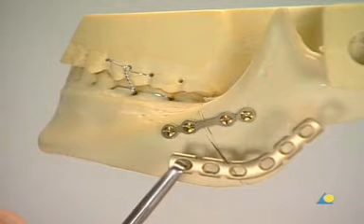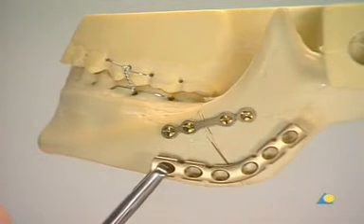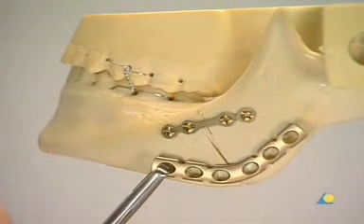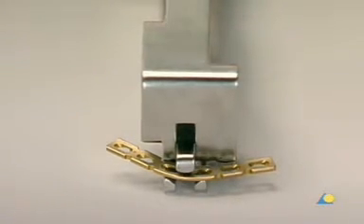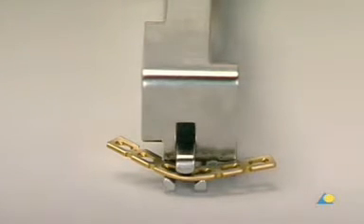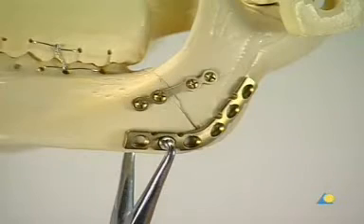An angled 2.4 universal fracture plate with 6 holes is selected to be attached to the lower border of the mandible with 3 screws on each side of the fracture. The bending pliers are used to contour the plate precisely to the mandible. A small degree of overbending is advisable so that the fracture does not open up on its lingual aspect. If the surgical approach is external, the contoured plate is held in place by using the plate-holding forceps.